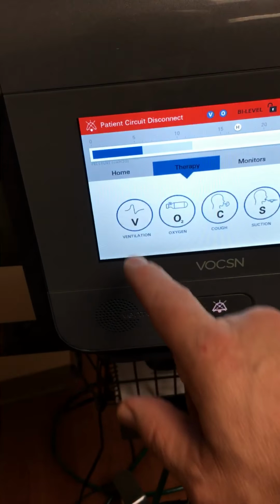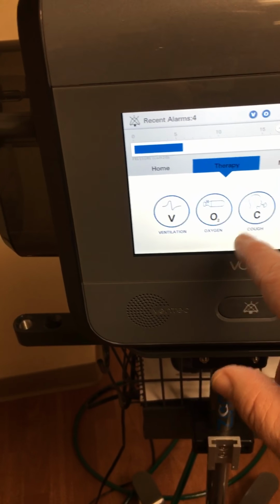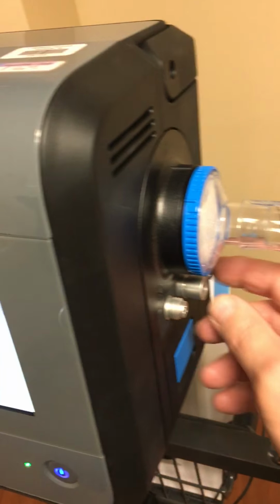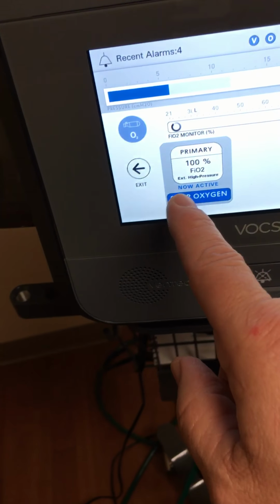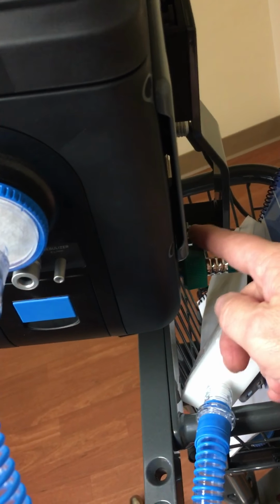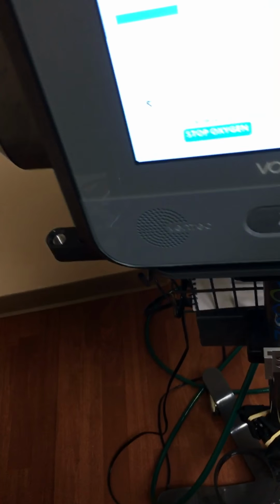And now when you go to O2, because this is not connected, it doesn't have the O2 mode, it's not passive with O2. So all I'm going to be able to use is external high pressure O2, or to bleed in O2 back here at the nipple adapter, and then change it to the low flow.